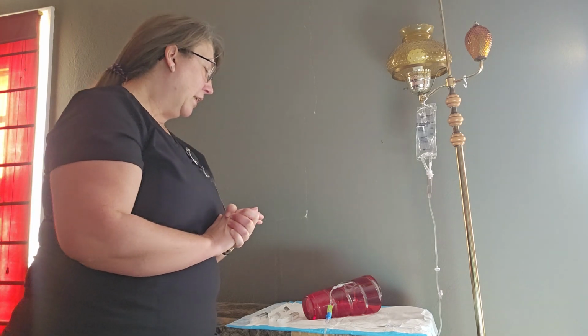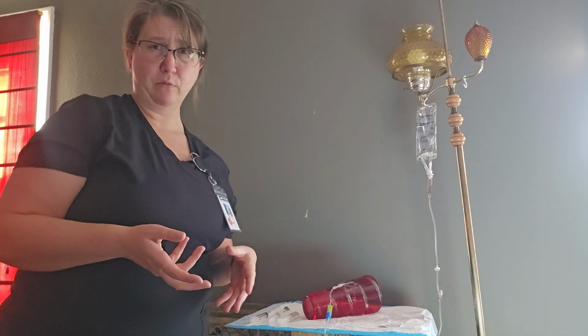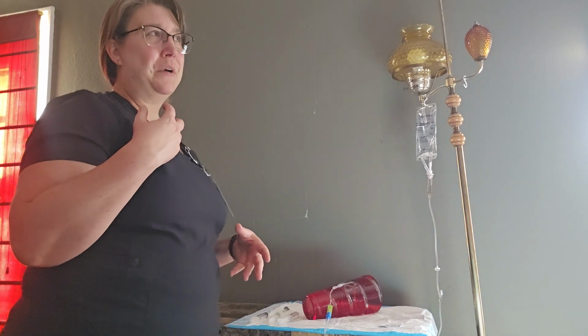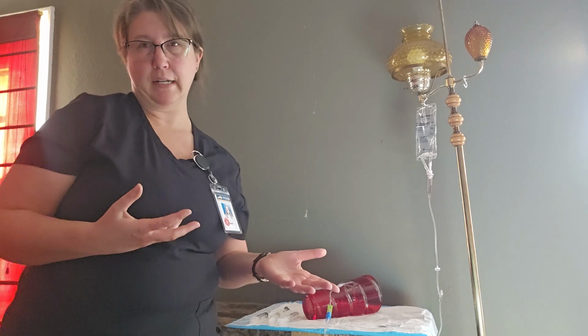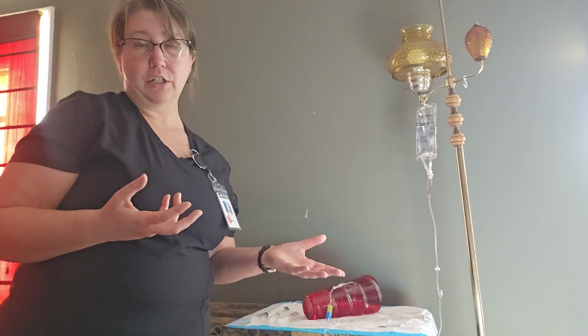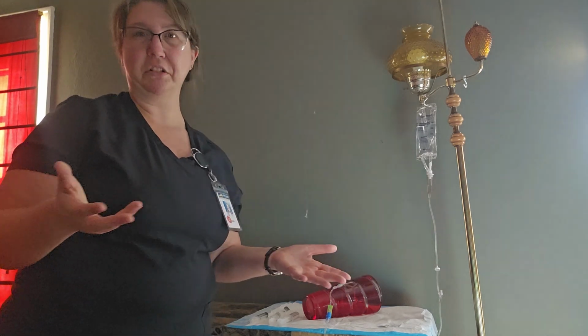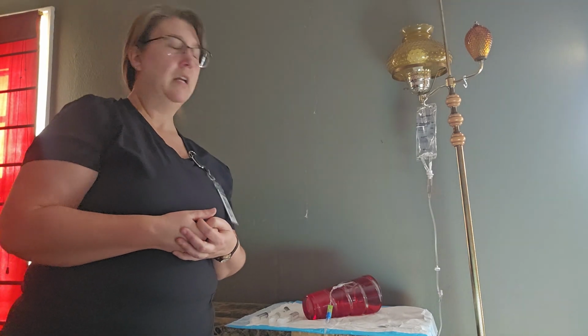Now at this point, I'm going to ask the patient, have you ever had this medication before? Did you have any reactions to this medication before? Do you have any questions about this medication? Is it okay if I proceed in giving you this medication? I'm just going to open the floor up to conversation, to any questions that the patient may have.